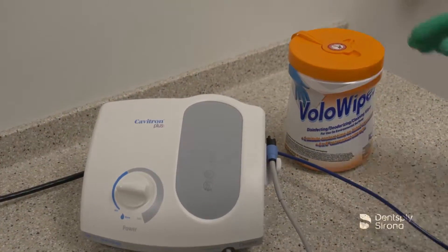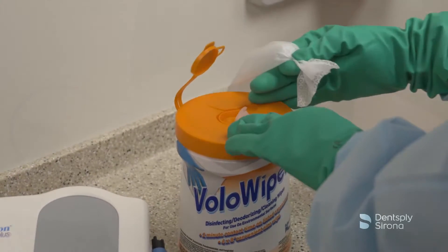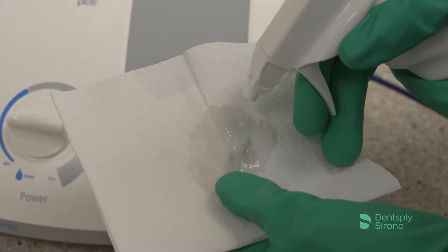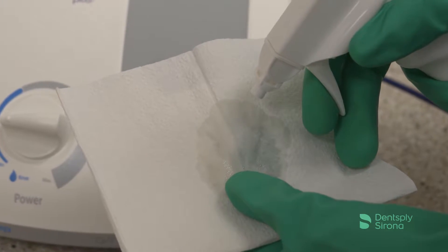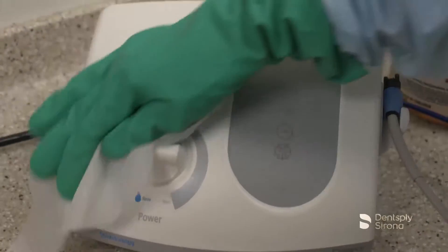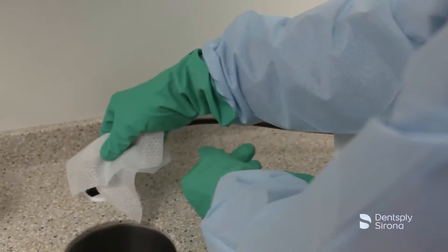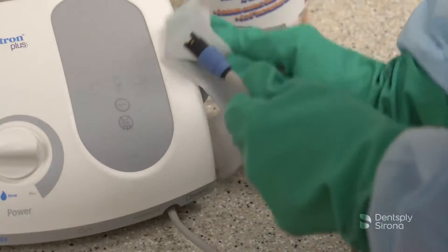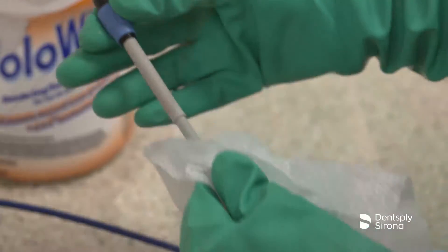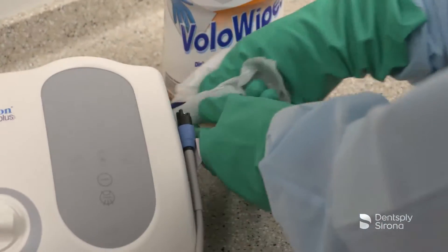To prepare the unit for the next treatment session, utilize a disinfectant wipe or generously spray disinfectant solution on a clean cloth. Do not spray disinfectant solution directly on the system's surfaces. Disinfect the surfaces of the cabinet, power cord, handpiece cable, tap-on foot pedal and cable assembly, and water supply lines.